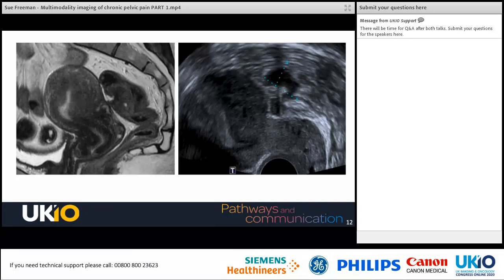In this case, the ultrasound was able to completely make the diagnosis, and MRI was only used in the preoperative planning of the patient. It's important that we fully understand how much of the bowel is involved, if it's just this section or are there any other lesions. And by using the two methods together, we can accurately plan surgery and also give preoperative counselling.